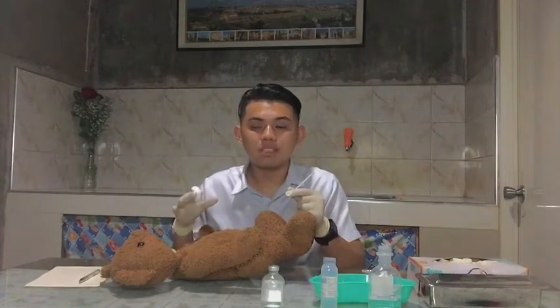Next is to secure the entry of the needle into the subcutaneous layer, and we'll be removing the needle cap to avoid contamination of the needle. Using the non-dominant hand, pinch or spread the skin at the site and insert the needle using the dominant hand in a firm, steady push. Pinching pulls the fatty tissue away from the muscle and makes the injection easier.